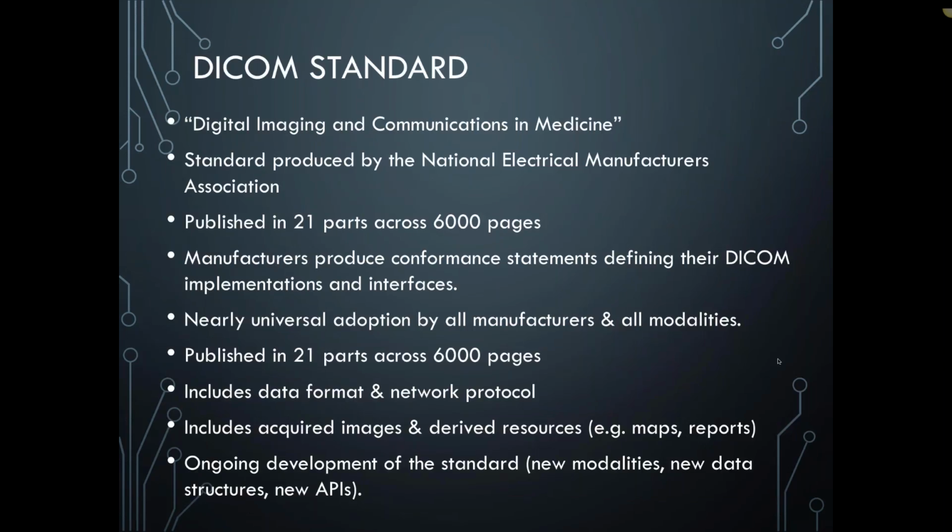All right, so we need to talk about the DICOM standard. This is the Digital Imaging and Communication in Medicine, although everybody just calls it DICOM. And this is the global standard produced by the organization called NEMA. And you know it's a standard because it took about 20 years to develop and covers over 6,000 pages of specifications.